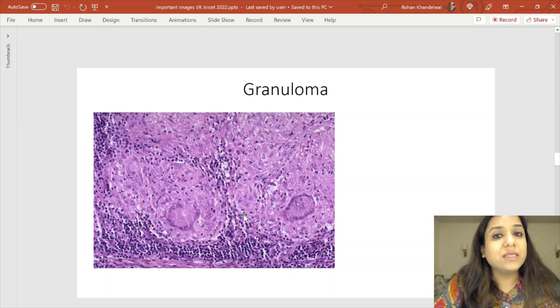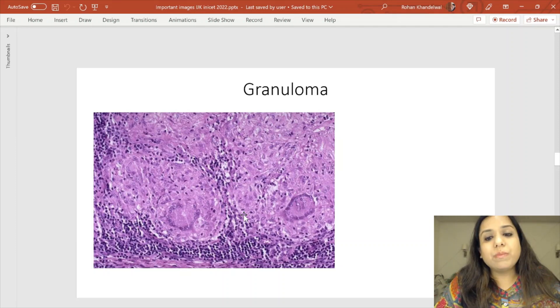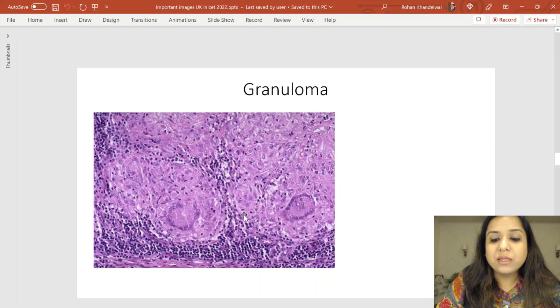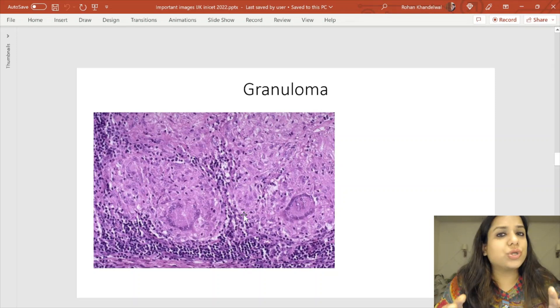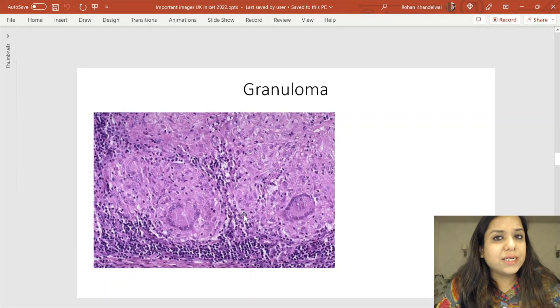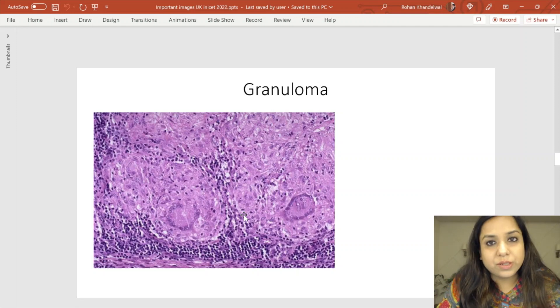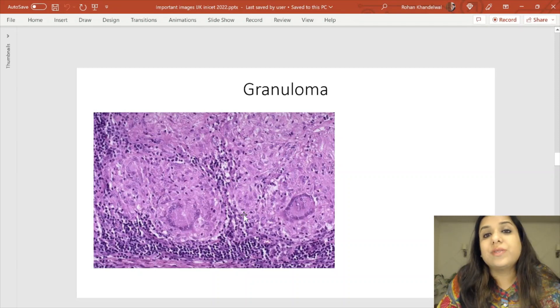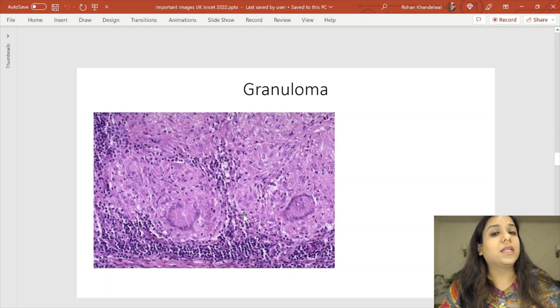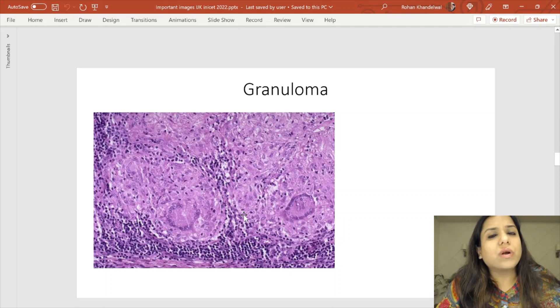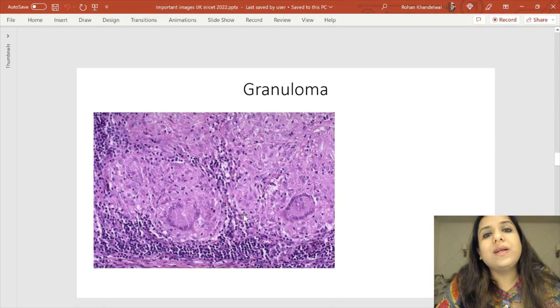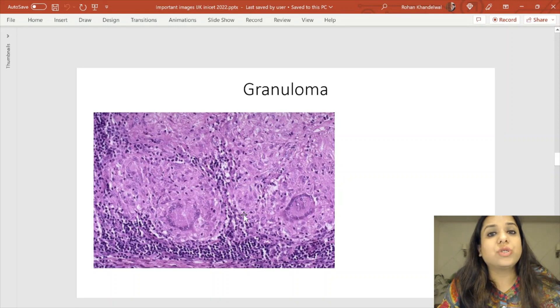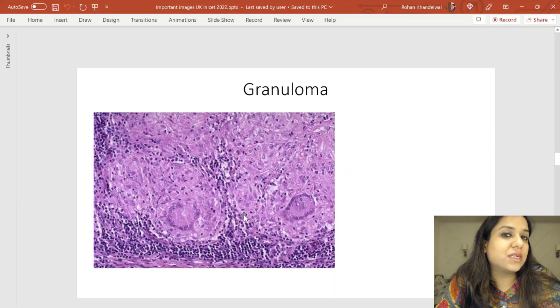The epithelioid cells are surrounded by a collar of lymphocytes visible at the periphery. Giant cells show a fusion or syncytium of many nuclei. In a caseating granuloma, you will see caseation necrosis. Granuloma is mostly a type 4 hypersensitivity reaction. The kind of giant cell seen in TB is called the Langhans giant cell. Please revise all granulomatous disorders and the types of giant cells.